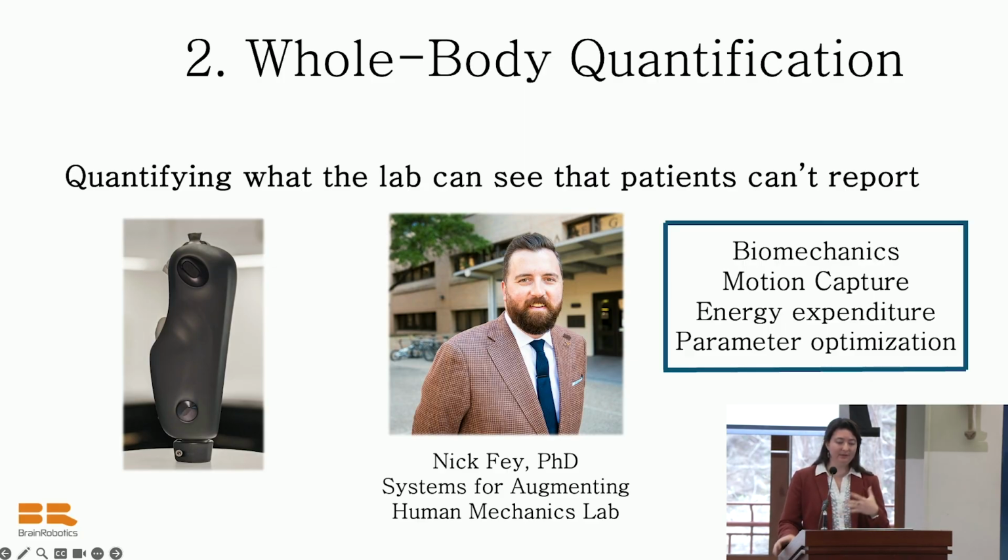And we're exploring parameter optimization to systematically identify the ideal settings for individual patients. That feeds both into clinical care and our broader understanding of what makes the device work well for different users.